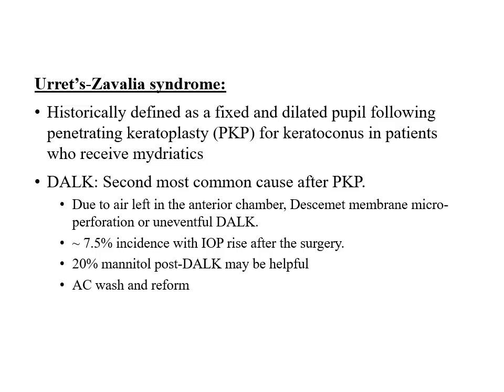and pressure rises. So 7.5% incidence with IOP rise after the surgery. 20% mannitol post-DALK may be helpful to reduce the intraocular pressure. And sometimes what happens is that even viscoelastic can cause this condition. So you might have to do an AC wash and reformation with an air bubble in such cases.